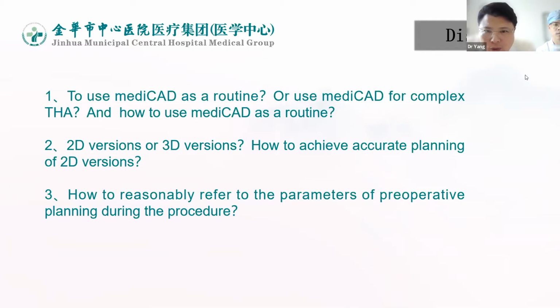And we want to know, you use 2D. Why do you not move to 3D templating? In my opinion, in 2D templating sometimes we cannot confirm the size and the fixation positions so well. So we want to know your experience, and lastly, how to reasonably refer to the parameters of pre-operative planning during the procedures.